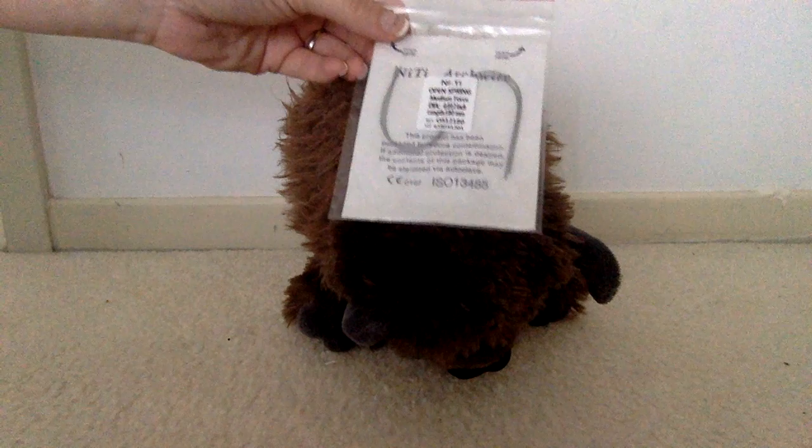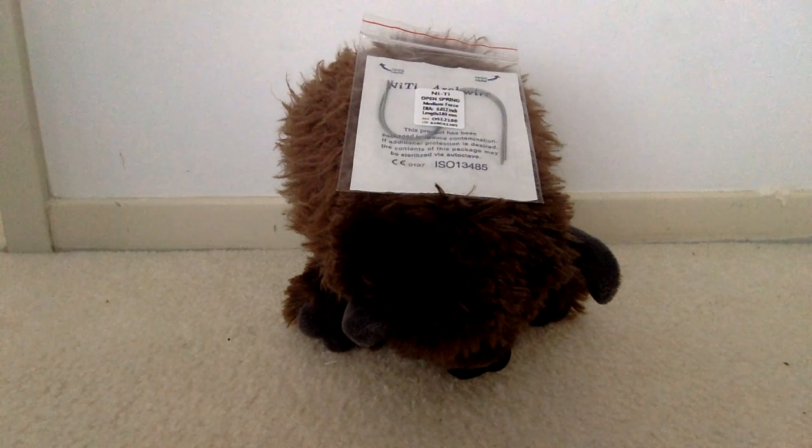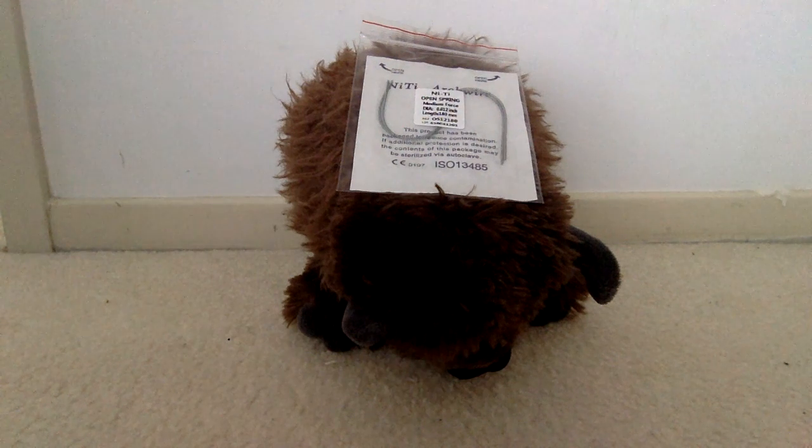So in any case, people get confused — there are different types of coil springs. For NiTi open coil springs, those are used to open spaces if you need to distalize or open a space with your orthodontics. You want to make sure that you're using the NiTi, not the stainless steel open coil spring — totally different.